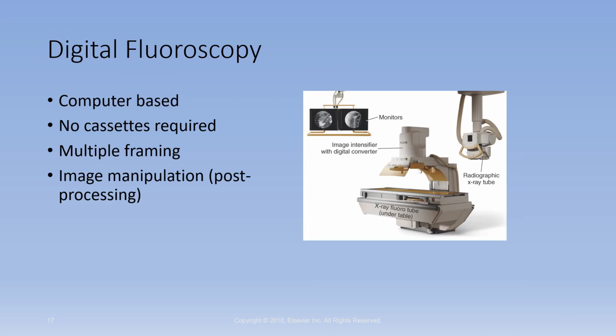With the digital fluoroscopy, this is on page 475. Typically, digital fluoroscopy is computer-based. We have no cassettes that are required anymore. You can do multiple frames in one session, and you can post-manipulate the image. Post-processing, you are able to manipulate that image.